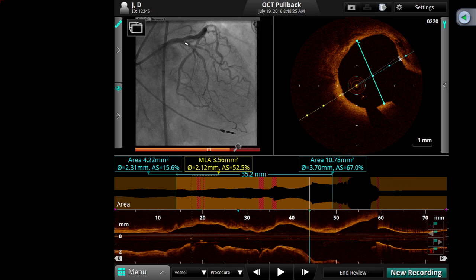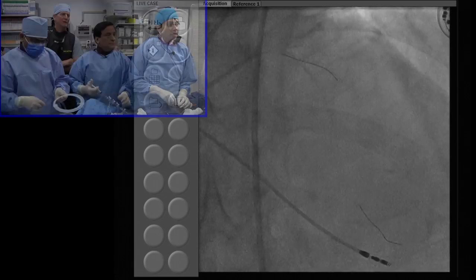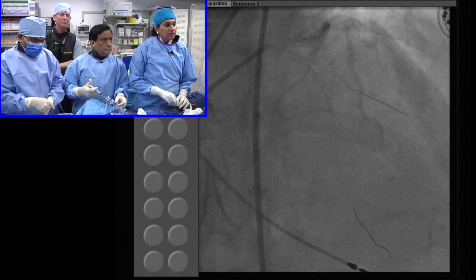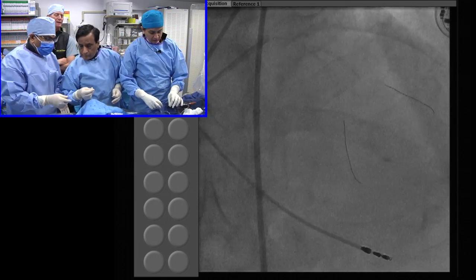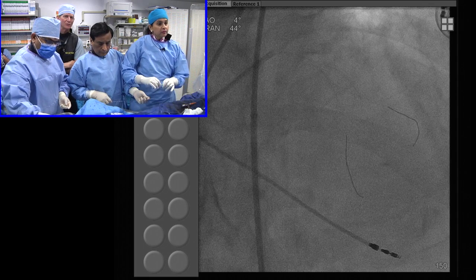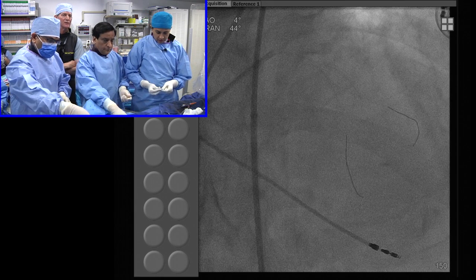Yes, we're recommending that, because what happens is you retrain your eye by doing routine imaging. Look at this case here. We all thought it was 3.5 millimeters. We actually have a 3.5 BVS ready, and it turns out it's really going to be closer to a 3.0. The proximal edge will probably need to be optimized with POT to make sure we've got apposition proximally, because this LAD really tapers a lot. But this shows you what imaging can teach you as you go forward, and it'll retrain the eye so that in the future you really won't have to use it in as many cases as you do in the beginning. It's a great learning experience in the early going.